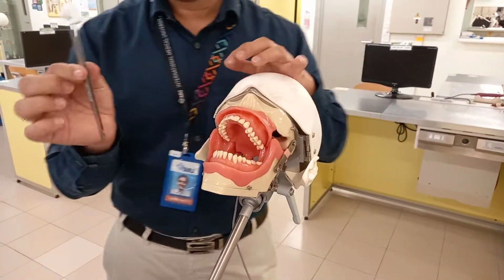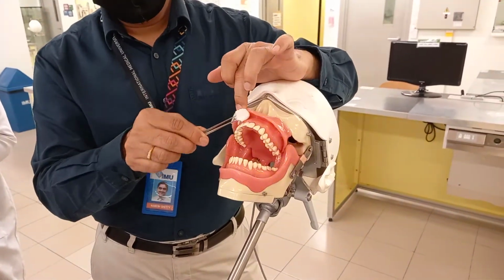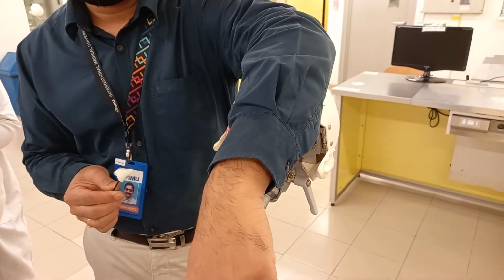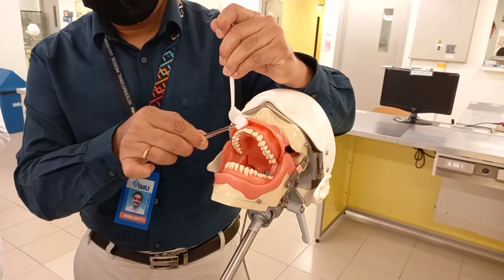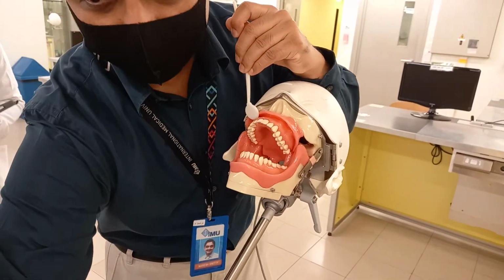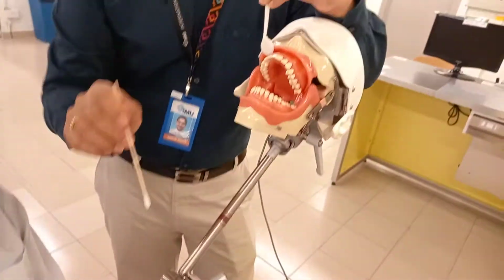So you take a tweezer, ask your assistant to suction first, clean the area, and then you wipe the area. You can give a mirror. You can take a mirror and retract like that. You see? And you wipe the area. Then you throw it. Then you take the applicator tip.